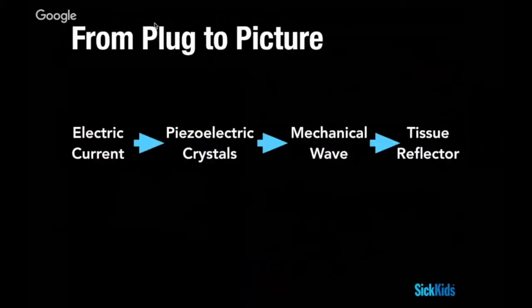And in terms of how the machines make this sound, they depend on an age-old quality called piezoelectricity, which just means pressure electricity. There are certain substances in the world that if you apply pressure to them, they will spit out electrons. Or if you apply electrons to them, they'll spit out pressure, kind of working bidirectionally.